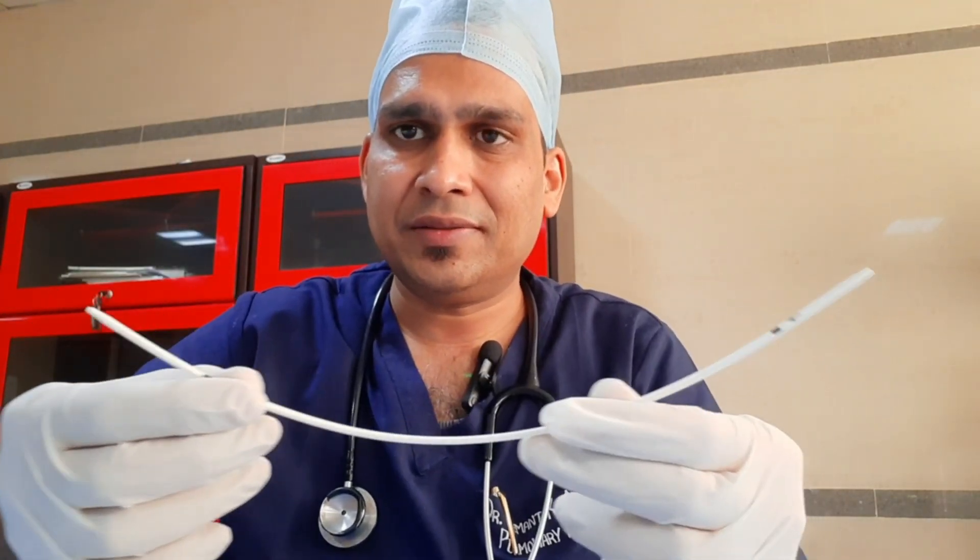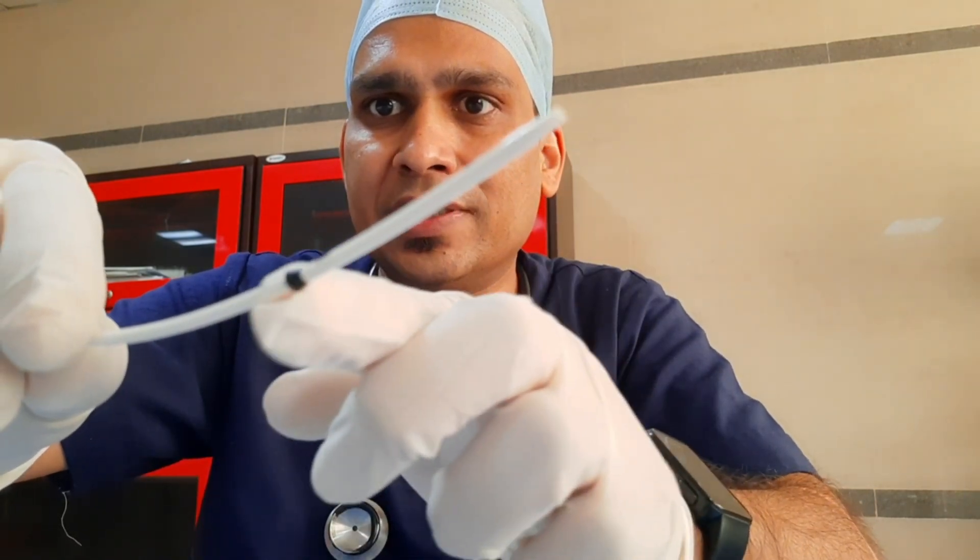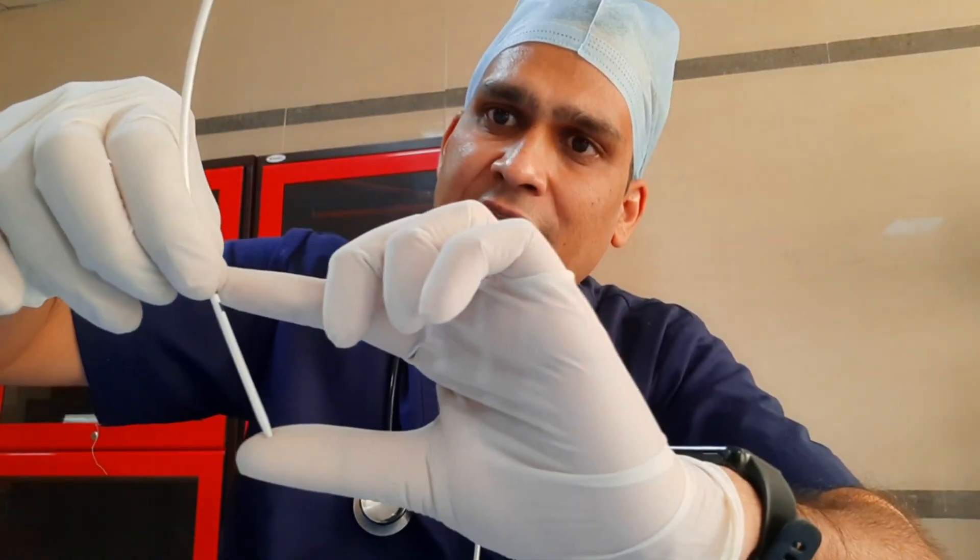This is the guiding catheter. You can see at one end it has some bulging — can you see this bulging? Once you are going inside the intertracheal space, this bulge is a marker for how much you have to go inside. This portion should go inside the trachea and the rest will stay outside.